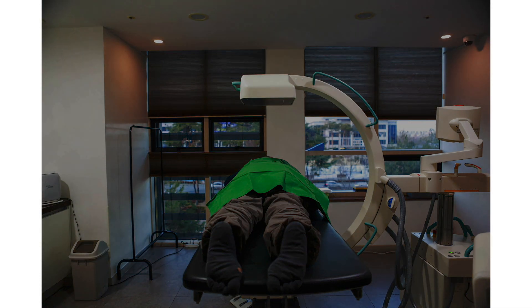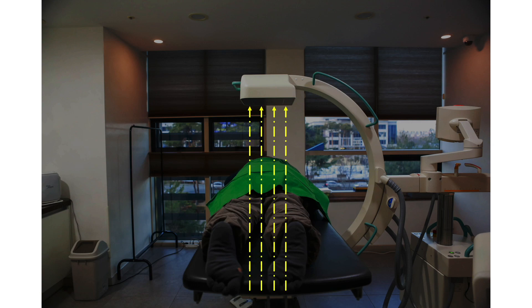Let me explain in more detail. The C-Arm is in AP view. This is the X-ray beam. The diverging yellow lines are the scattered radiation from the patient's body. If I put the lead curtain under the table, it cannot block the scattered radiation from the body.